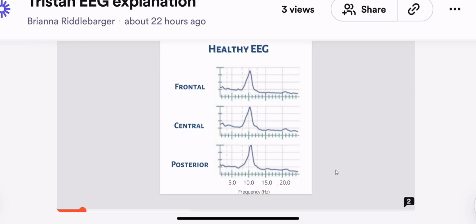The reason why we have him in that state is we want to measure during that time, do his brain waves match the state he's supposed to be in. The awake eyes closed state is called the alpha wave state. And alpha waves we are measuring because we want to see where they're at. And then MERT actually helps treat alpha waves to improve them. The reason why the focus is on alpha waves is because they are associated with mood stability, mental clarity, focus, stable energy, stable sleep, kind of everything that we care about for wellness. So we measure those alpha waves.